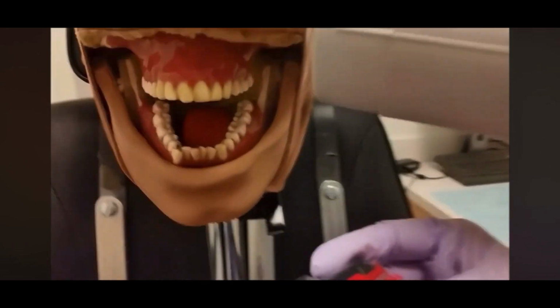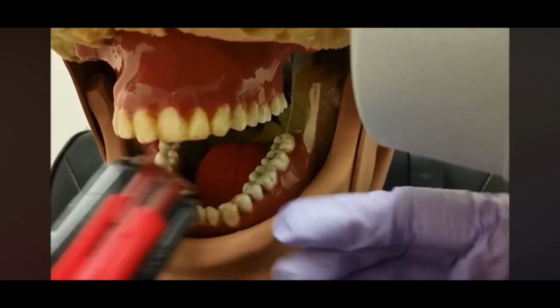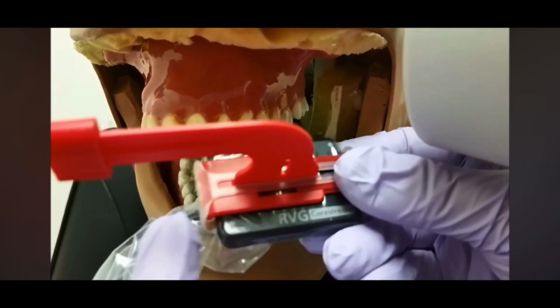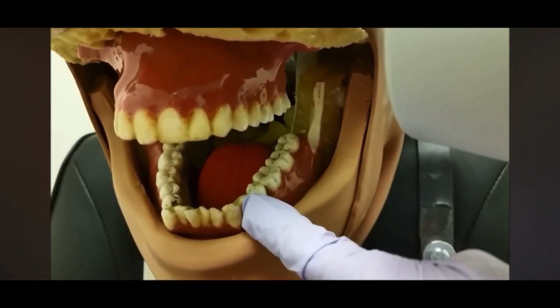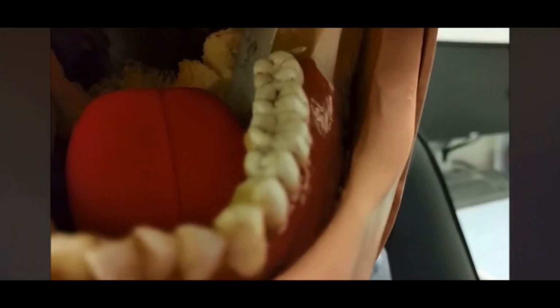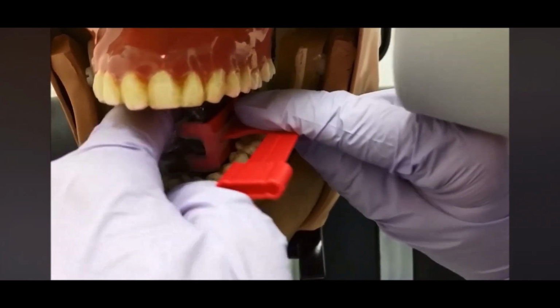Here are a few more tips for taking bite wings. We're going to keep the cone close to the patient so that it's easy to access and the patient doesn't have to hold the sensor in their mouth for a long period of time. We want to use a number 2 sensor. We want to put the distal portion of the sensor up as close to the canine as you can get. I want to place it in the center of the mouth.